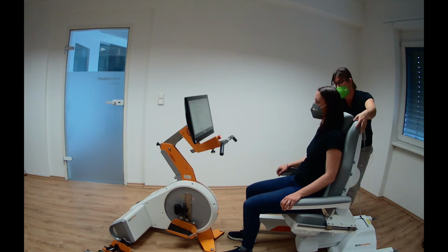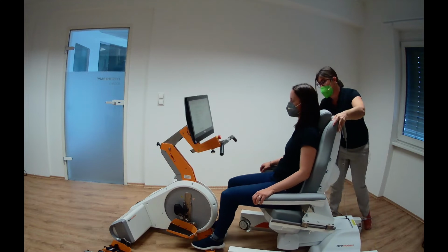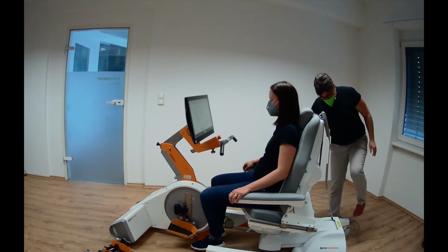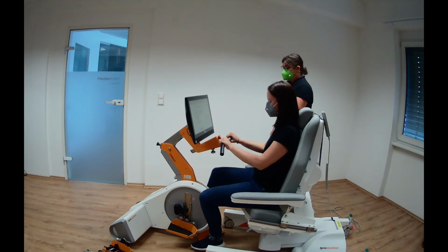Afterwards, we can move her with the chair around so that we can place her in front of Omego in a central position, as close as possible. Afterwards, we fix the brake and we can start the therapy more or less.